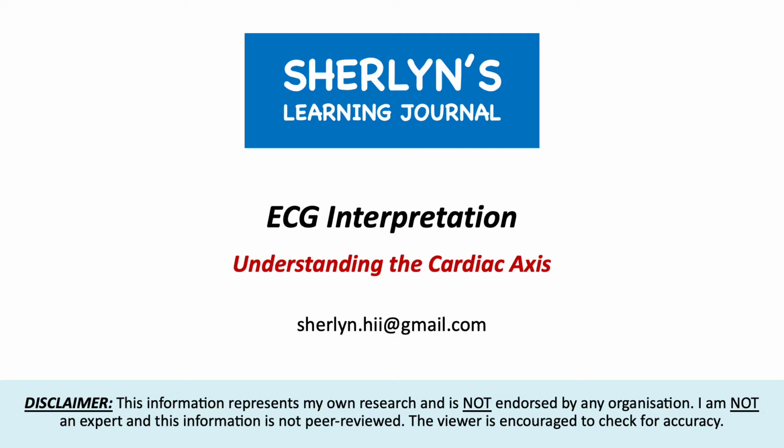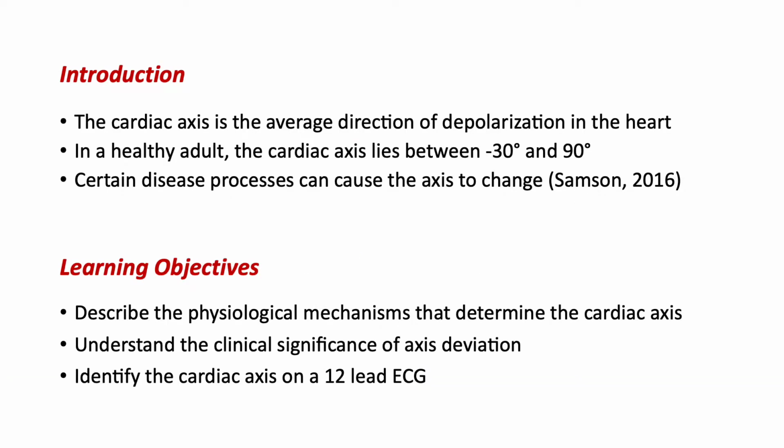And in my undergrad degree, we don't really get into ECG interpretation very deeply, which is why today I'm going to talk about this concept of cardiac axis. This is a concept that I came across while I was doing some research for a Para 213 essay. I was actually quite disappointed that we didn't get to cover it in our main syllabus because I feel like this is a very important aspect of ECG interpretation. In fact, some textbooks usually go on to refer to the cardiac axis as a basic skill of ECG interpretation. So without further ado, let us begin.